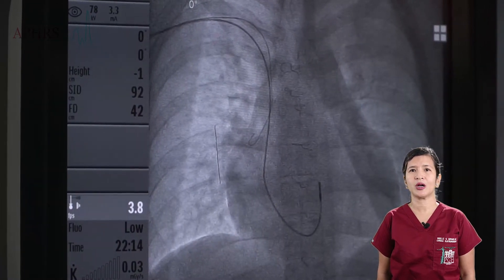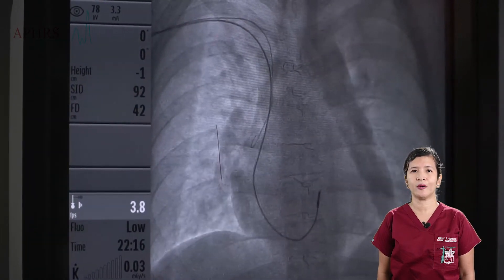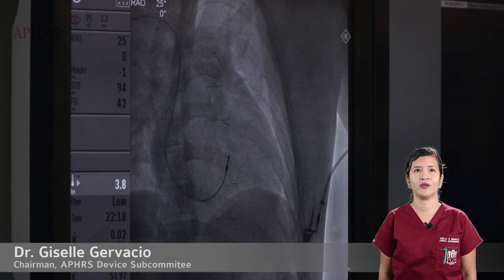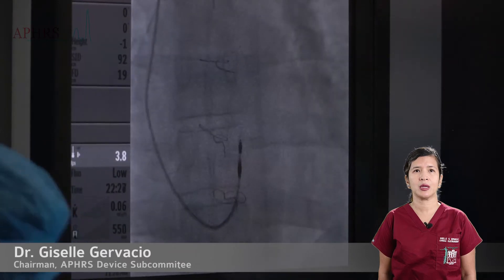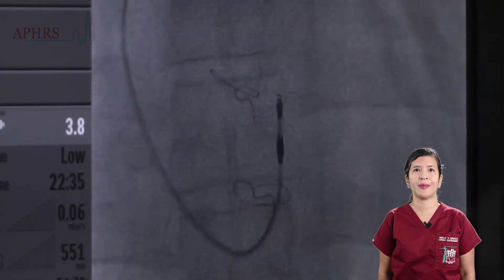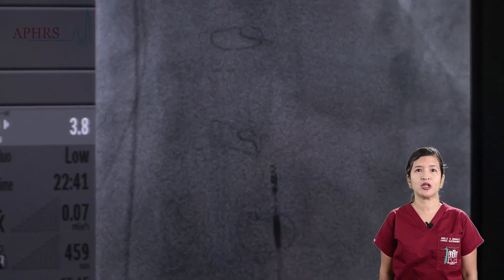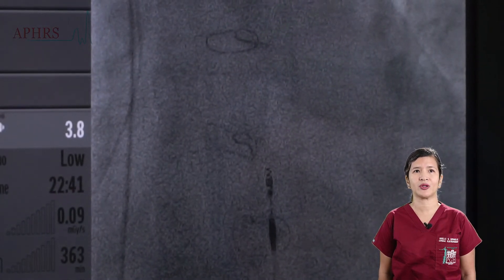While a counterclockwise torque is applied to the lead to increase the probability of lodging it at the His bundle area, the image is checked on both RAO and LAO views. The screw is then deployed by turning the pinching tool several times and visualizing the image using a magnified view. One will see the screw being deployed and the separation of the metallic part of the end of the lead into two parts, confirming full deployment of the screw.